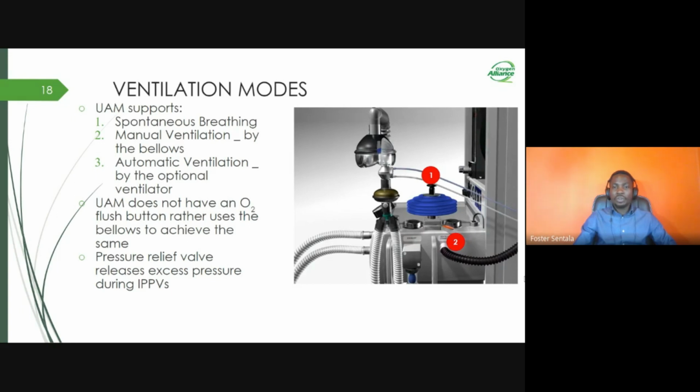Just a point to note, this model of anesthesia machine does not have what is known as an oxygen flush button. Rather, it uses the same bellows of manual ventilation to achieve the same purpose. Moving on.